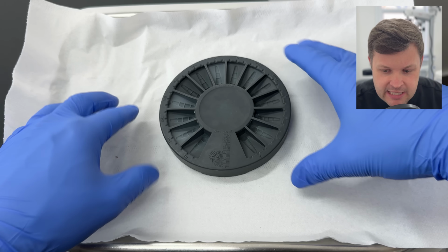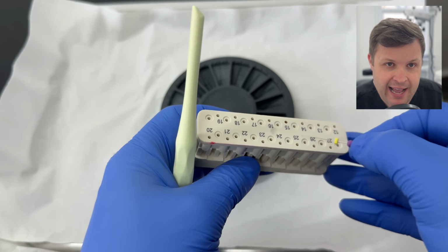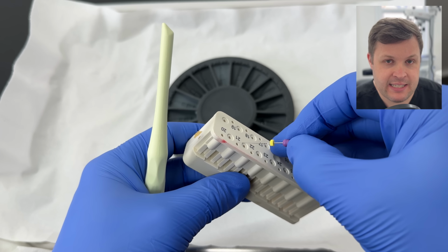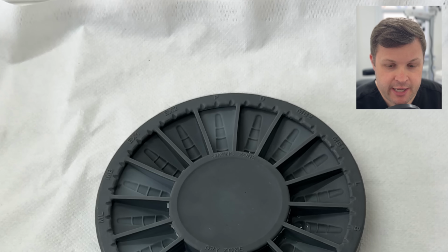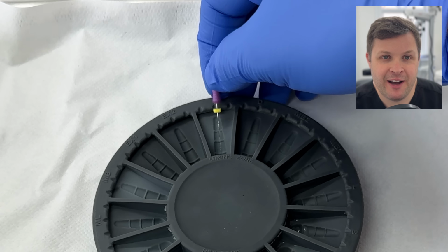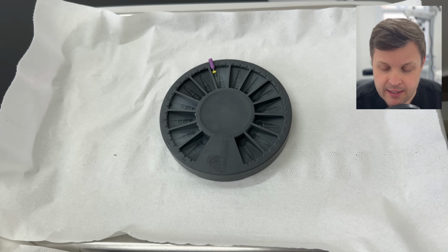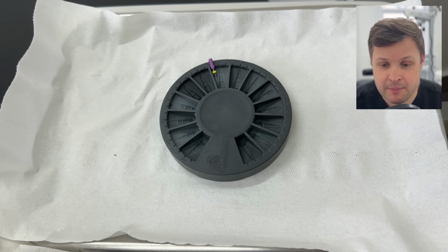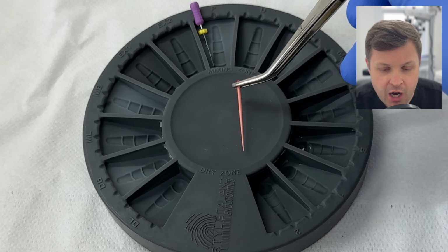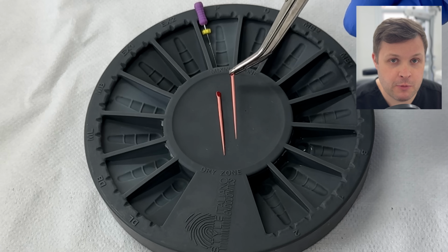I'm going to get the working space area nicely set up. I am getting my hand file in our disinfecting ring straight away, ready to disinfect. What I don't want to do is start the obturation and then realise I haven't put the hand file in any disinfectant, because we need to place the hand file to length, as this is going to introduce the bioceramic all the way to the end of the tooth, and if it isn't disinfected, you're just introducing bacteria into the canal space. Then we are placing a couple of little cones in the middle here, all ready to go.